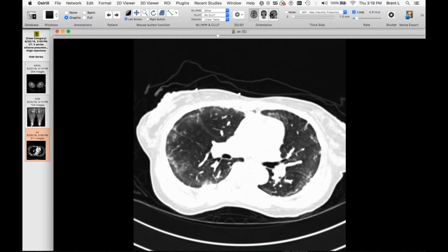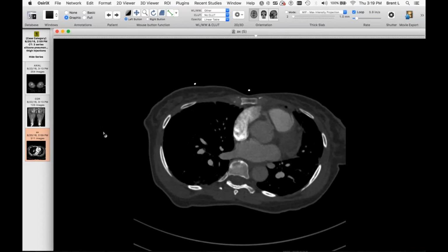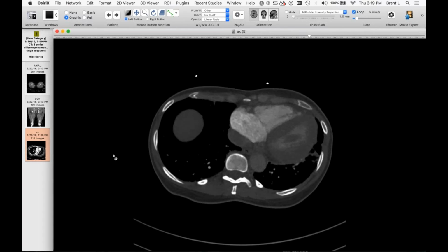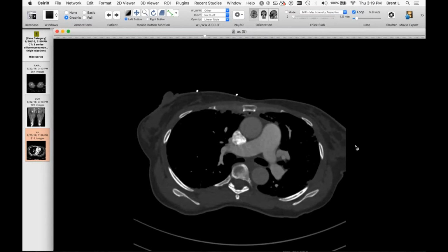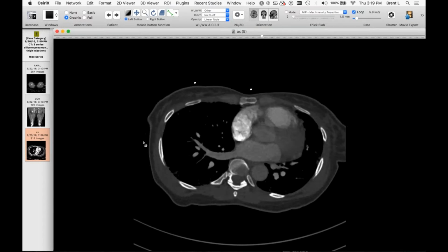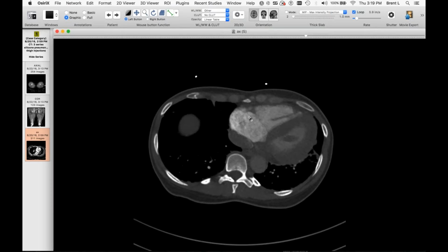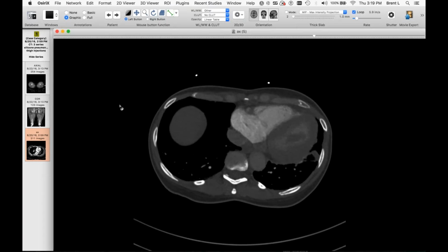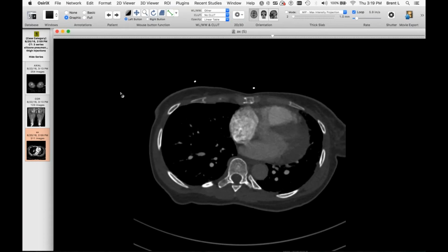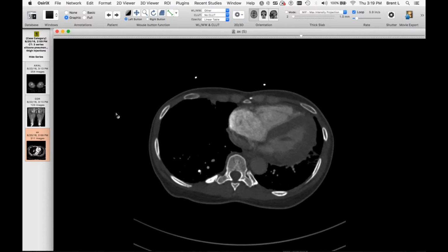Hey, Brent, was there right heart failure? I don't remember the echo, but you can see that there was some straightening of the septum, and I was showing the pulmonary artery was a little bit on the larger side. So presumably we are seeing some elevated right heart pressures here. Septum certainly abnormal. The right atrium's enlarged, and she did present with an arrest. So not sure I remember the echo findings, but certainly we see evidence of right heart strain here.